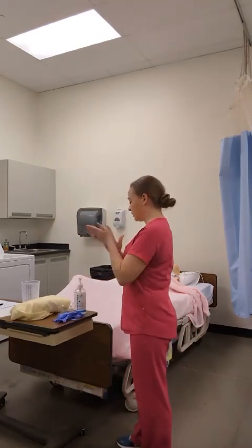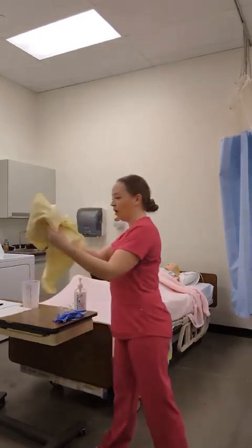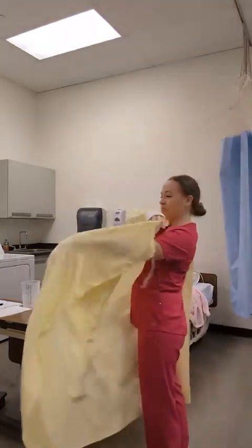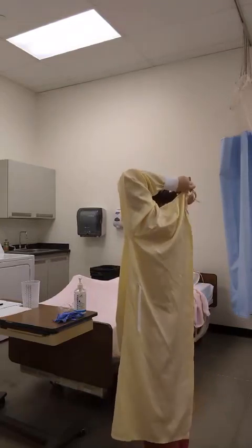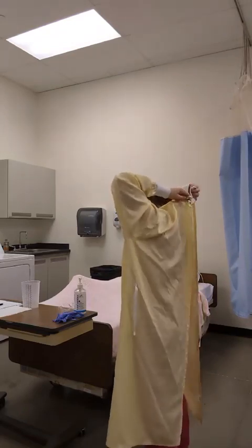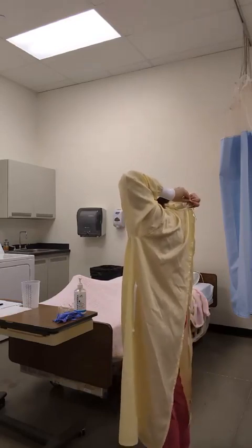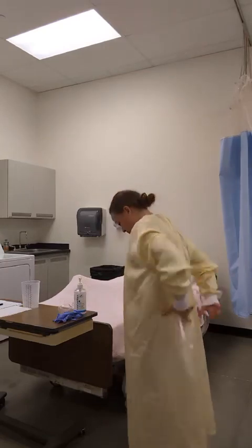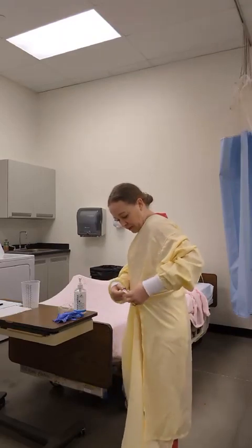I will first hand sanitize by making sure that I cover all areas of my hands. I will unfold my isolation gown, making sure to tie it at the neck and making sure that my gown covers my back by tying it at the waist.